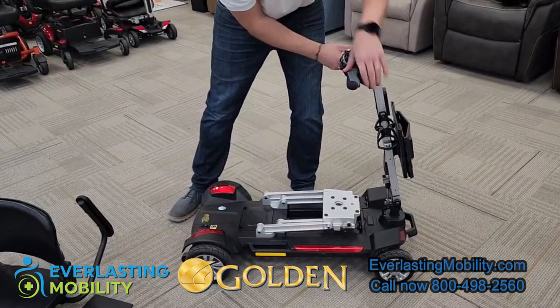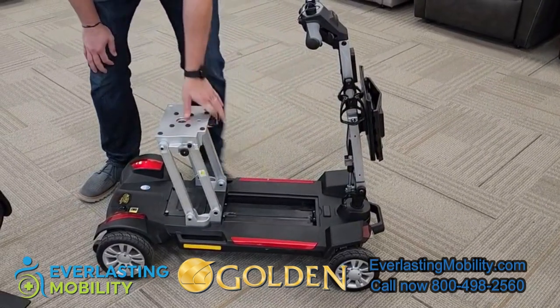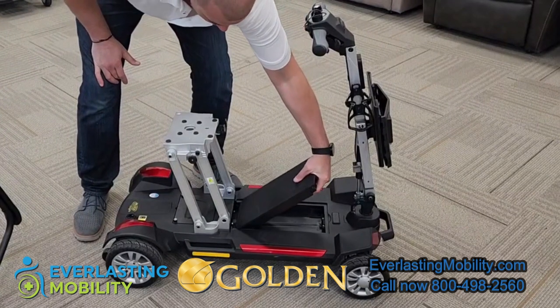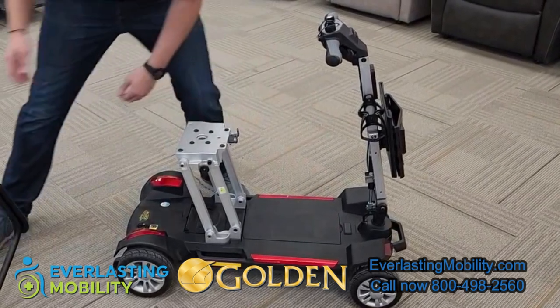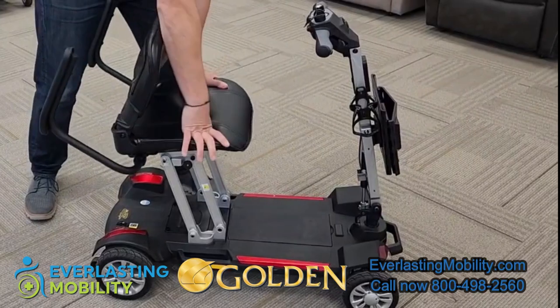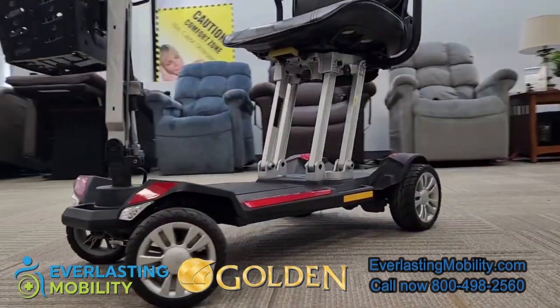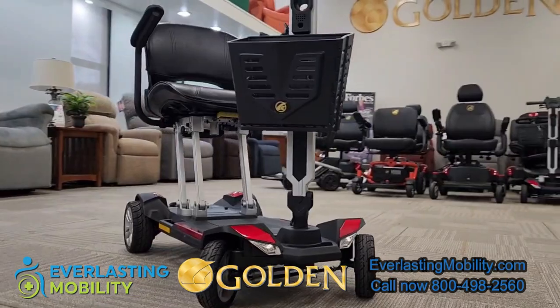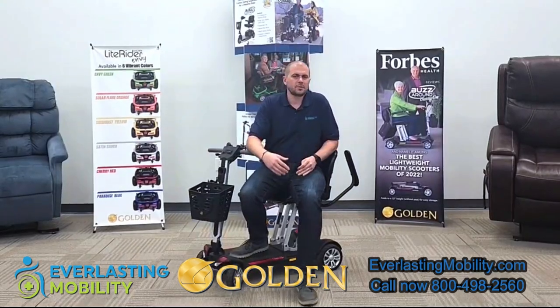To reassemble the scooter it's equally fast. First, press the lever to put the tiller up into an upright position comfortable for you. Next, lift up the seat frame and move it up until it clicks into place. Easily put the battery back in with the metal prongs lined up on the correct side — when you hear the click, the battery is secured. Finally, put the seat post into the hole of the seat frame, snap it into place, fold the armrests down, and you're ready to go.